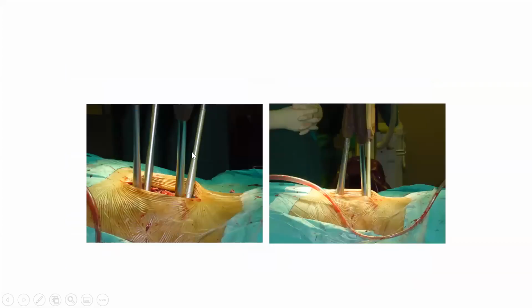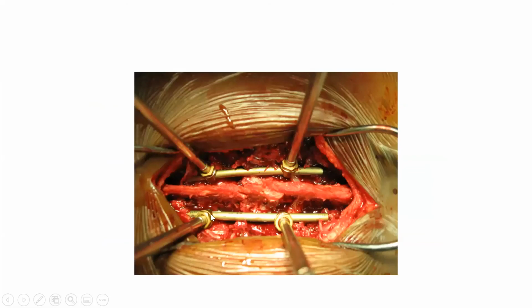So you have the screws inserted in the patient, and they're probably slightly convergent. Here you can see I'm closing down, so I'm diverging the screws in front and restoring the lordosis at this level. It's just an intraoperative picture. Then you lock these screws onto the rods, so you fix an angle. You can also distract them, putting a distractor on these screws to restore your vertebral body height.